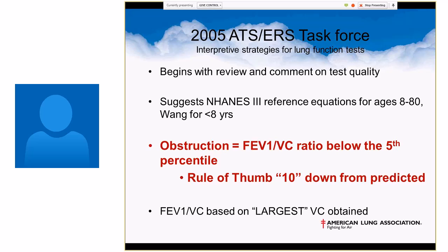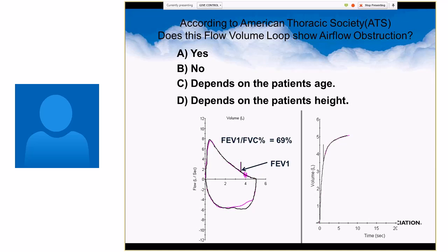This is right out of the American Thoracic Society's 2005 interpretive strategies for lung function tests. Obstruction is the FEV1 over the FVC below the fifth percentile, and again, we're going to talk about the rule of thumb down 10 from predicted. So here's our pre-test question. According to the American Thoracic Society, does this flow volume loop show airflow obstruction? We have A, which is yes, B, no, C, depends on the patient's age, or D, depends on the patient's height.